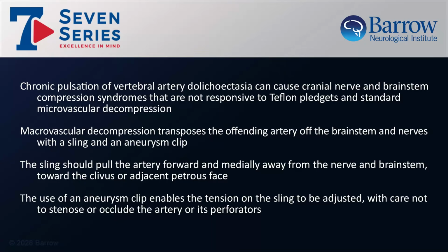In conclusion, chronic pulsation of vertebral artery dolichoectasia can cause cranial nerve and brainstem compression syndromes that are not responsive to Teflon pledgets and standard microvascular decompression. Macrovascular decompression transposes the offending artery off of the brainstem and nerves with a sling and aneurysm clip. The sling should pull the artery forward and medially away from the nerve and/or brainstem and toward the clivus or adjacent petrous face. The use of an aneurysm clip enables the tension on the sling to be adjusted or fine-tuned, with care not to stenose or occlude the artery or its perforators.